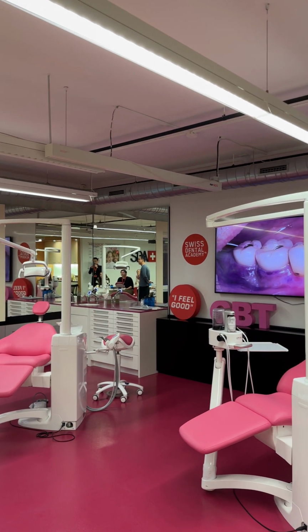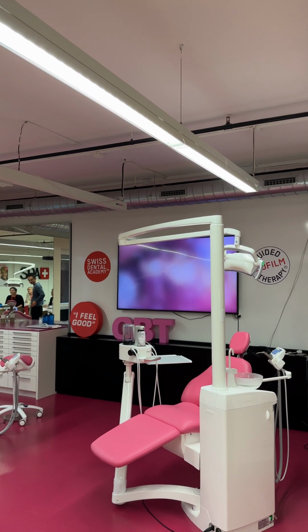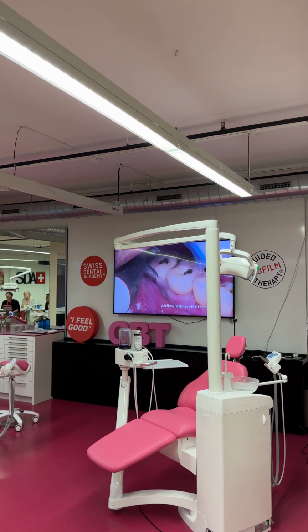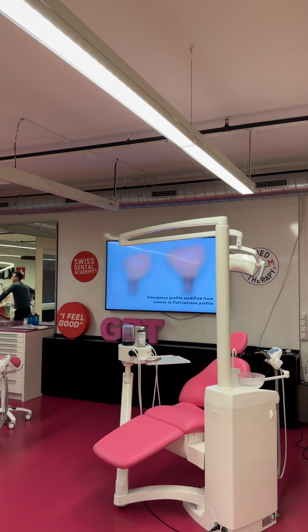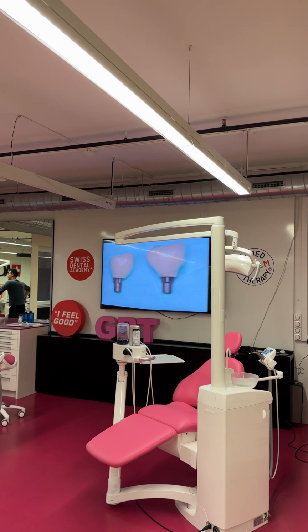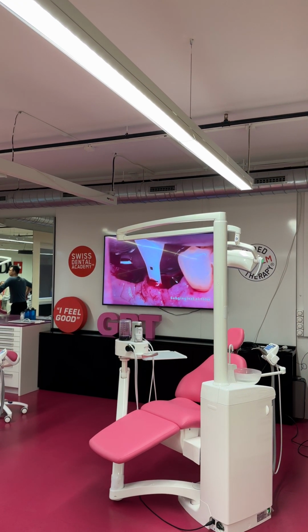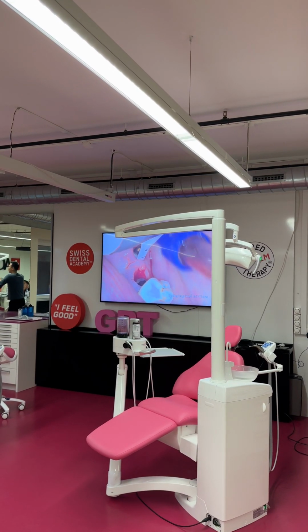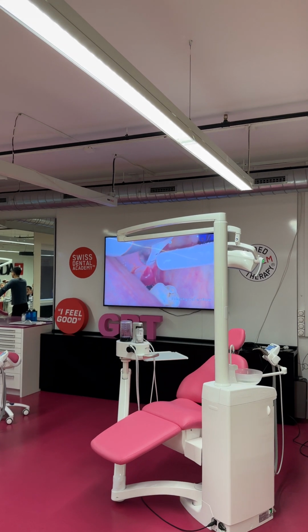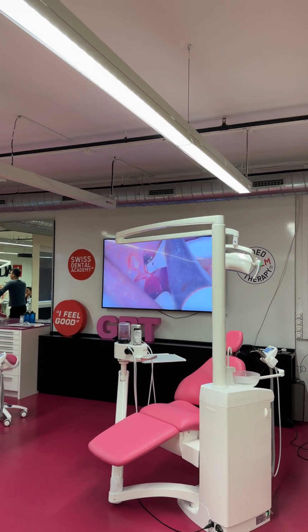Okay, so we just close. This is a non-surgical treatment. We just close and supragingival airflow. And we remove the crowns, we retain crowns, make the emergence profile more cleansable, easy to ID cleaning, and then we probe again. And then subgingival airflow. And here, this is before Xiaosu came to Hong Kong, so this is not the right way of doing this. For educational purpose, I'm showing you how I did it not correctly.